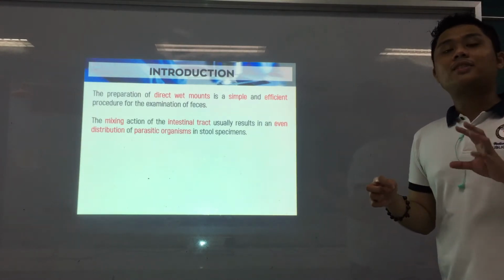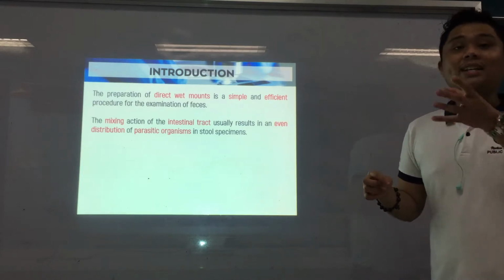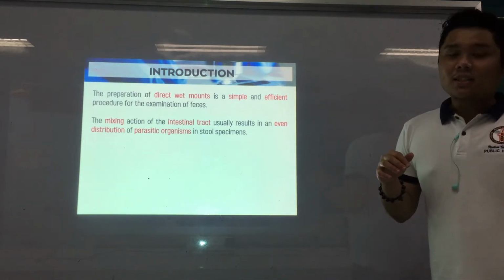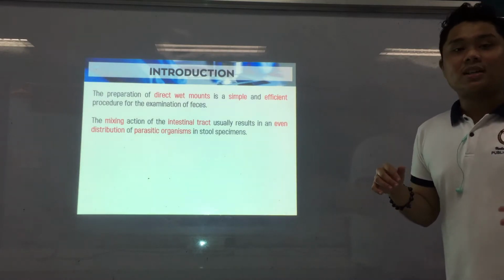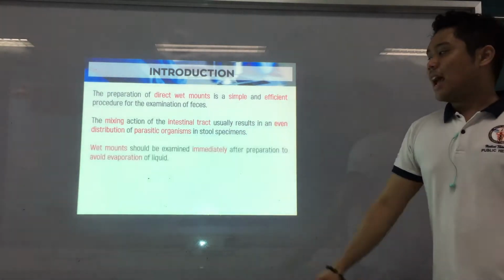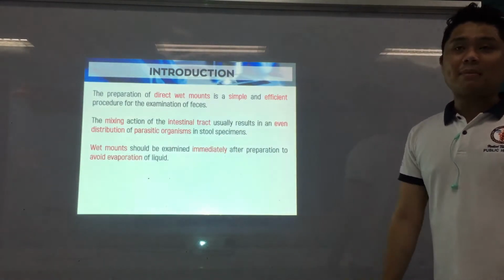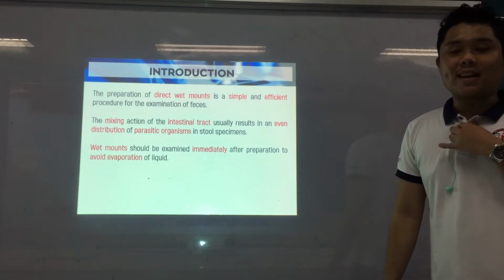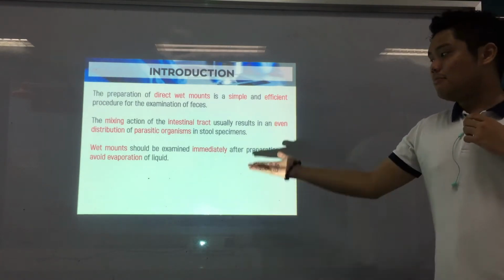So you can expect that in your stool specimens you can really see some parasites, or the parasites that cause the disease, because of this mixing action. Next, wet mounts, by the name itself, it's wet. So you add a liquid, a reagent that is liquid. It should be examined immediately.